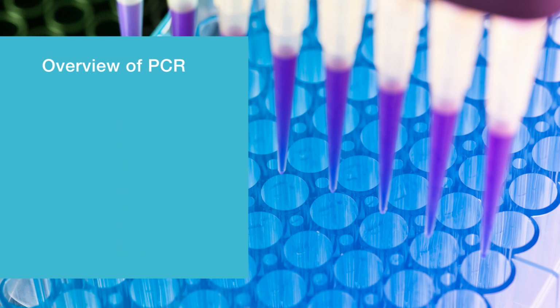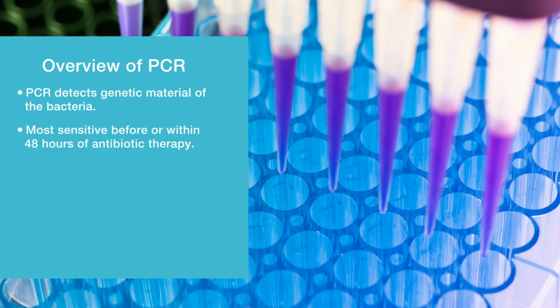Rickettsial diseases can be diagnosed using PCR. PCR detects genetic material of the bacteria. The ability to detect genetic material decreases after appropriate antibiotic treatment, so these methods are most sensitive at the time of or within 48 hours of antibiotic therapy.